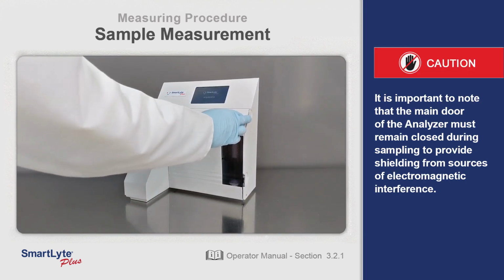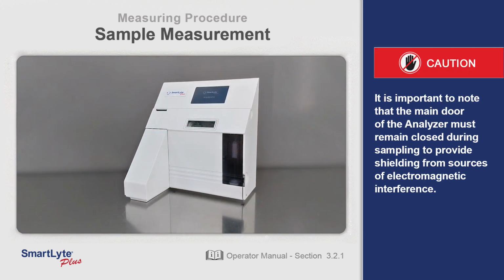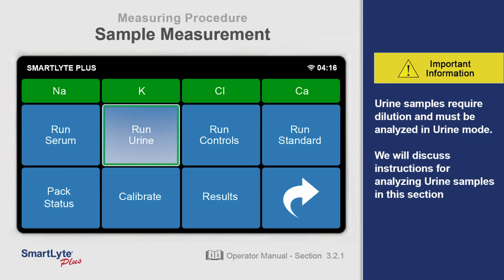It's important to note that the main door of the analyzer must stay closed during sampling to provide shielding from sources of electromagnetic interference. Urine samples require dilution and must be analyzed in the urine mode. We will discuss instructions for analyzing urine samples in this section.